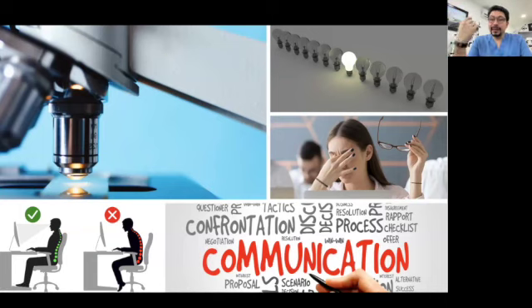And the fifth one is the communication. The communication that we can have with our patients and the communication that we can have with our referral doctors. In endodontics, we have referral doctors. We need to send a report about what we did. And when you add those clinical pictures, the understanding between the practitioners is going to be good.